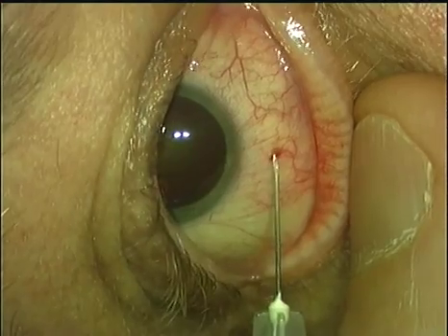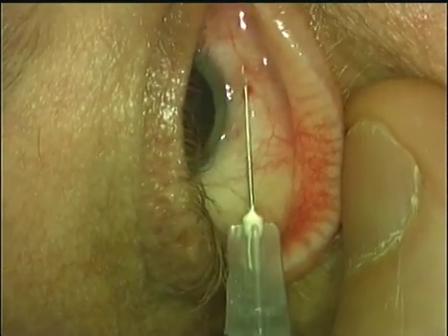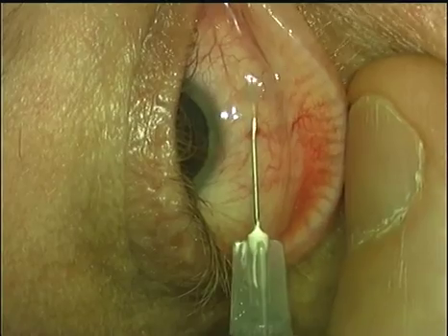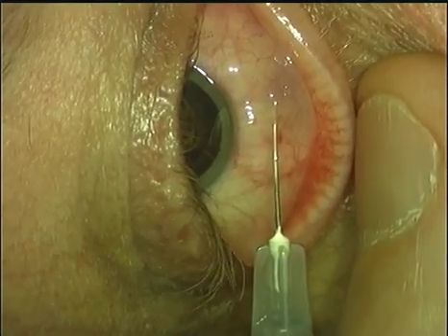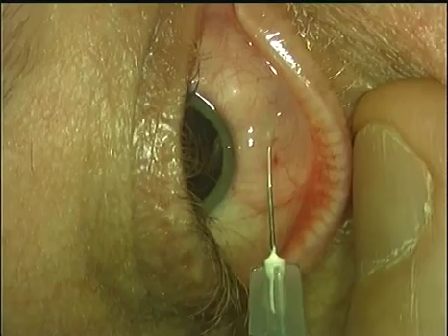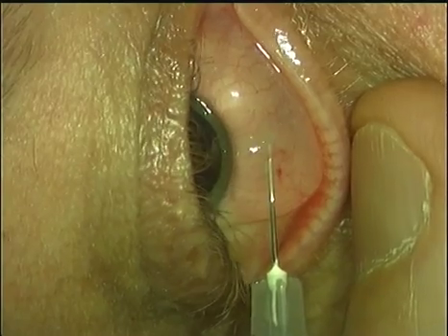About 30 seconds later we give the main injection, and this is a maximum of one cc. We try to avoid the sub-tenon space because anaesthetic within the sub-tenon space doesn't diffuse particularly rapidly, as opposed to the sub-conjunctival space where it spreads around very well. You can see it going around the limbus there, and that's why this is called a perilimbal infusion.